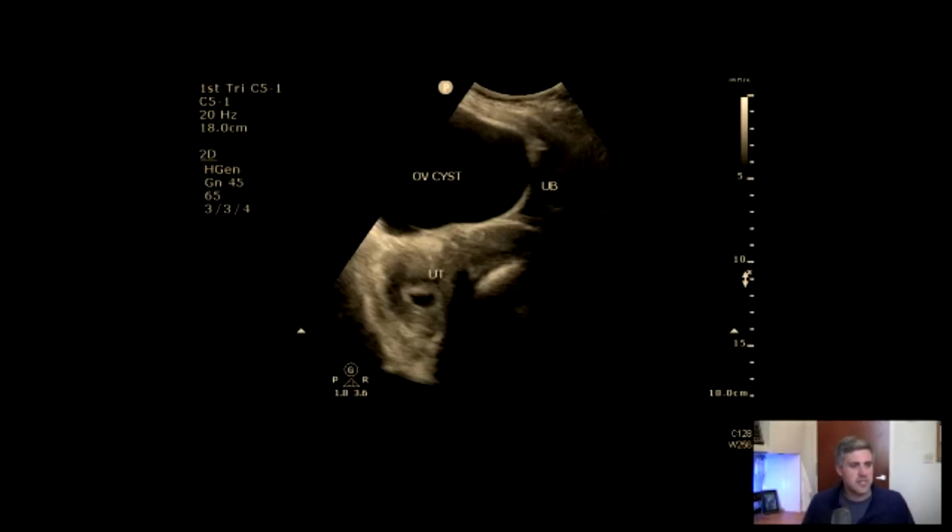And so here we can see, obviously, it's a sagittal oriented view of the female pelvis, right? And so the uterus is not unclear, right? We saw that in the previous image. But you can also see a very decompressed urinary bladder indicated by UB there. And if we really found that pubic symphysis, walked it right above the pubic symphysis, we would have seen the decompressed bladder and then this large fluid collection adjacent to that, we would have said, you don't have 2 bladders, you must have 1 bladder.